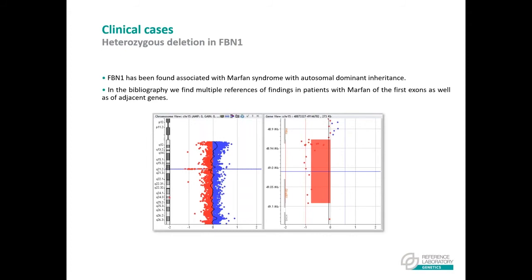This case could not have been completely resolved by MLPA because it could not discern the implication of the second gene.